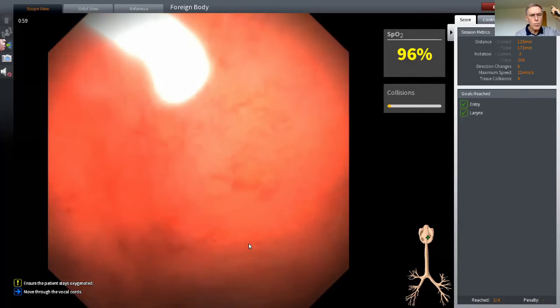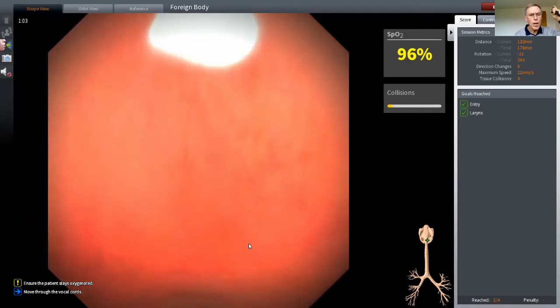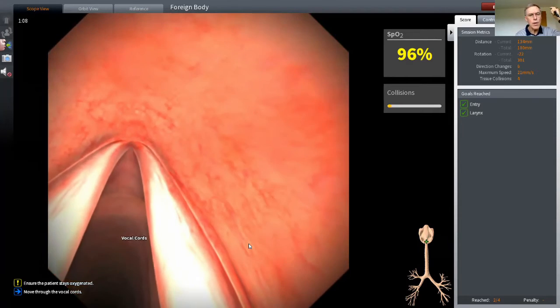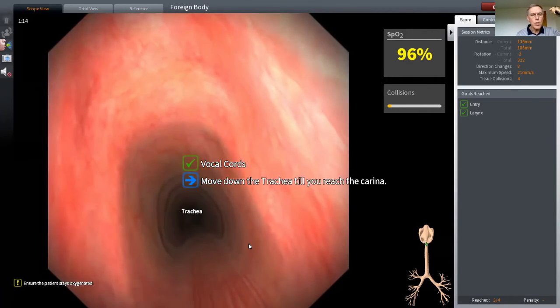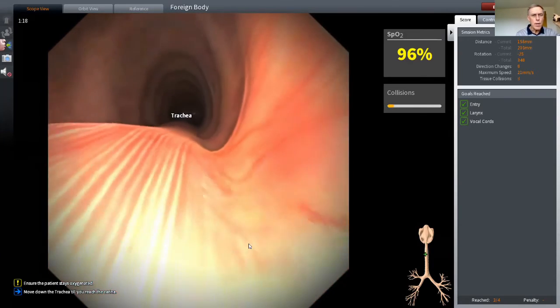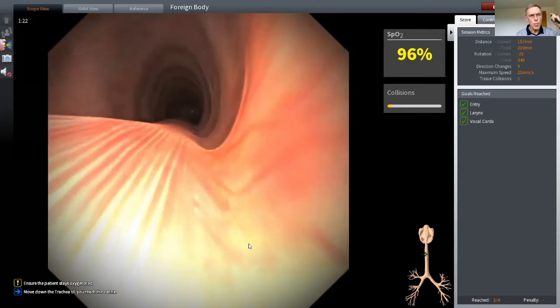There's the anterior commissure just behind the vocal cords. So through there, I'm going to adjust the tip angle on the bronchoscope by pushing the lever of the bronchoscope up. This model is animated, so we can see vocal cord movement, and we're into the child's trachea. So that's an oral intubation, and at that point I can place a tracheal tube and remove the bronchoscope.